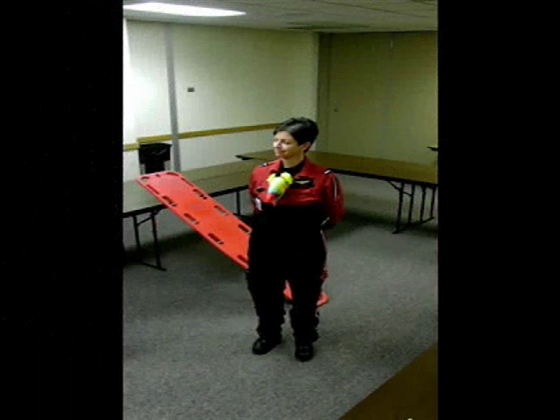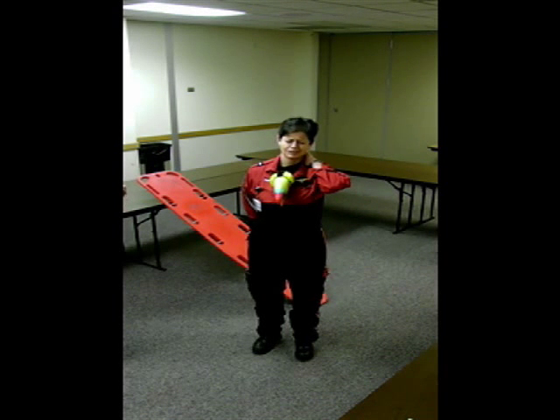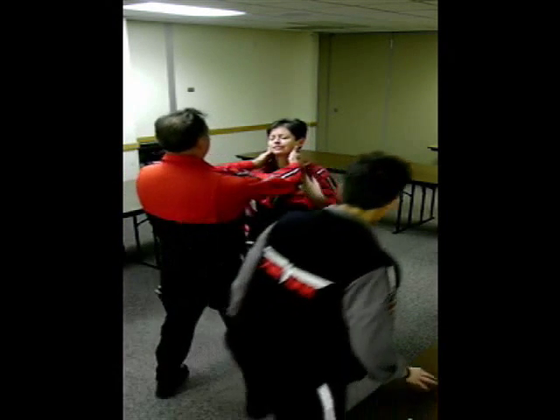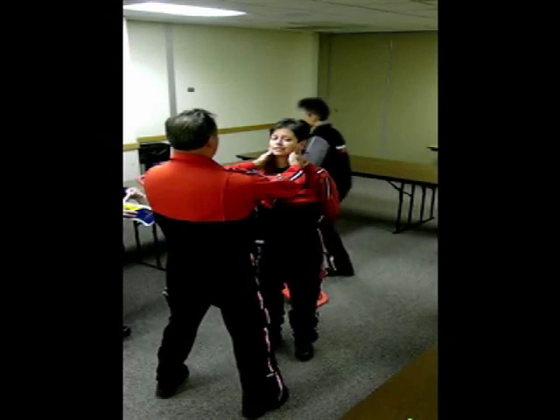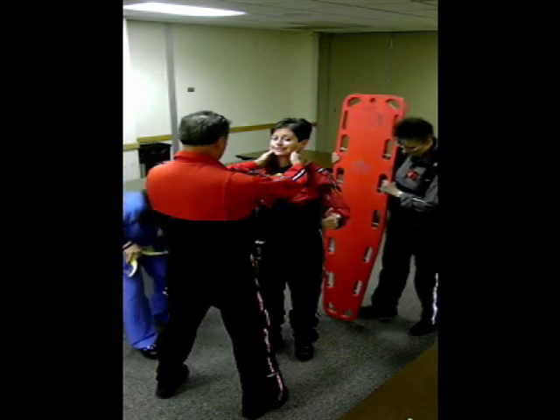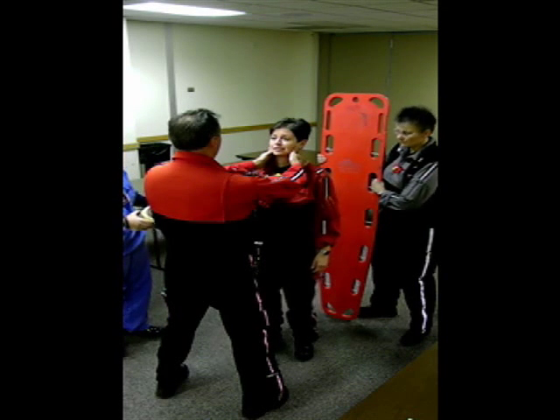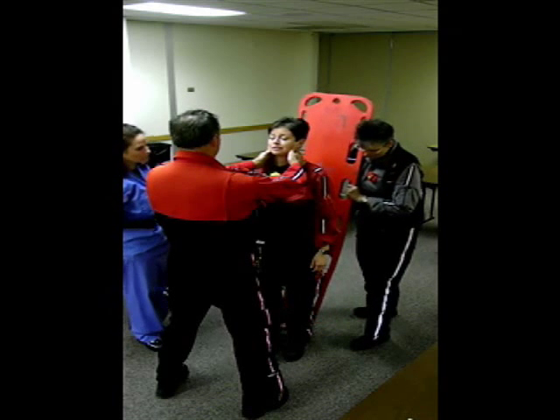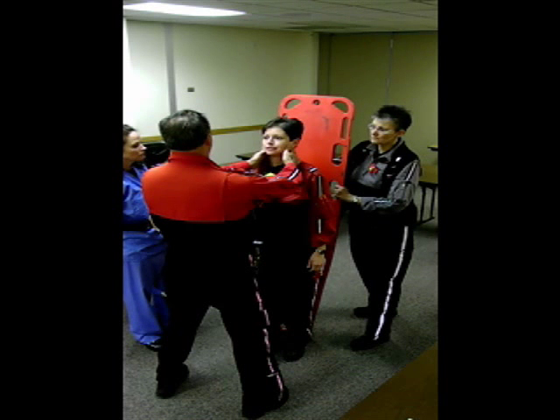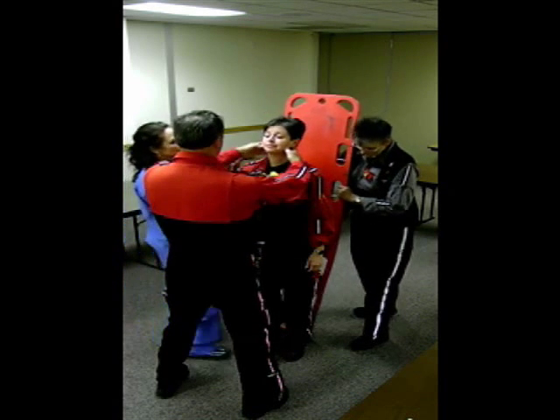When we encounter a patient on a call and we decide that they require C-spine immobilization but they're standing, the first thing we need to do is come up and hold manual C-spine traction. The best way to do that is to stand in front of the patient so that they don't look around. You can also go ahead and evaluate distal pulse movement and sensation at this point. Ask them if they have any numbness or tingling, because you're going to want to re-document that again after we immobilize this patient. The next thing we need to do is explain to the patient the procedure we're going to do — we're going to put a C-collar on them and lay them back on a backboard on the ground. So we'll go ahead and put the C-collar on.